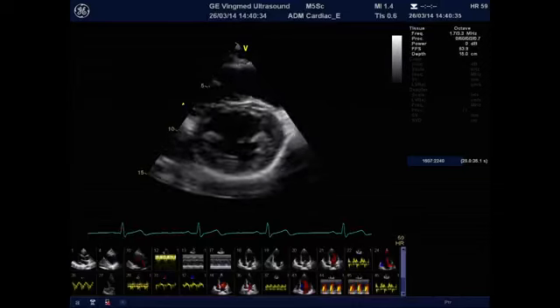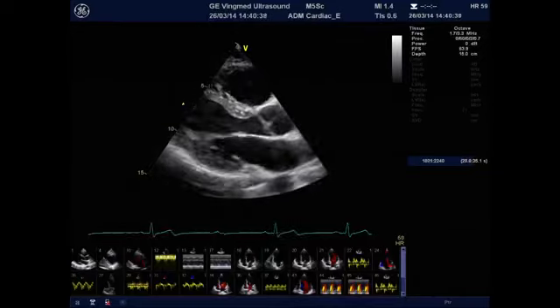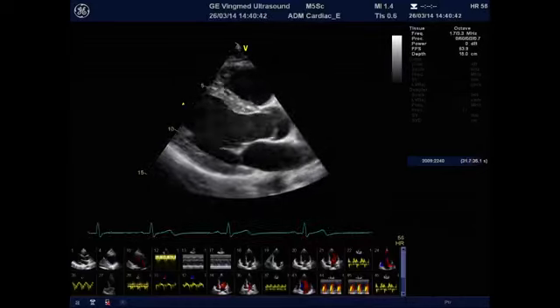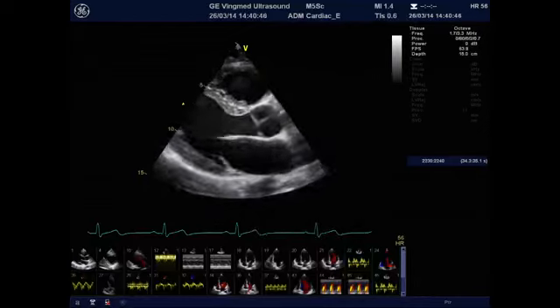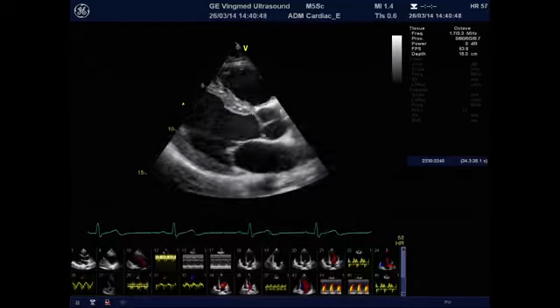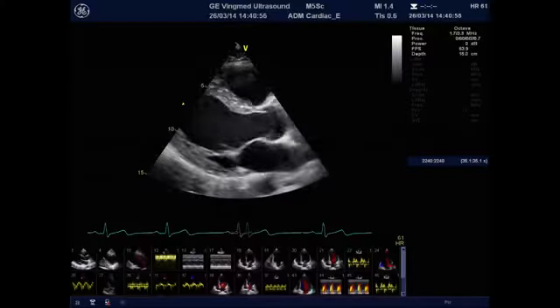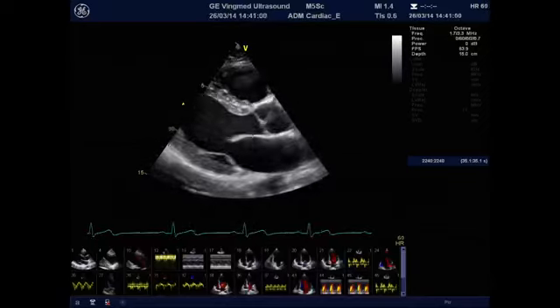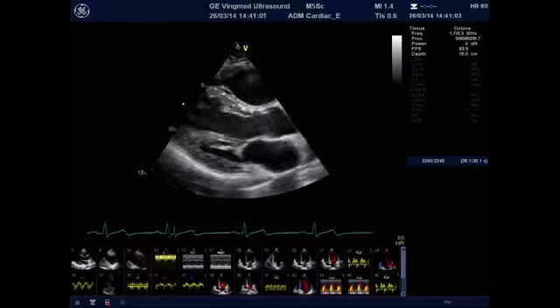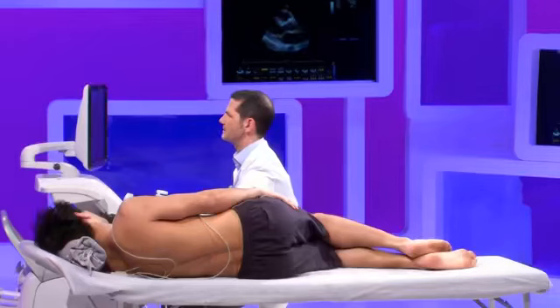They also represent criteria to be used to make the diagnosis of heart failure with preserved ejection fraction, an increasingly recognized and prevalent entity. So it is very important that we have a good ECG tracing, because many of the things that we'll measure will need to be concorded with the ECG tracing, and this is very important for the timing of events and for all the measurements.